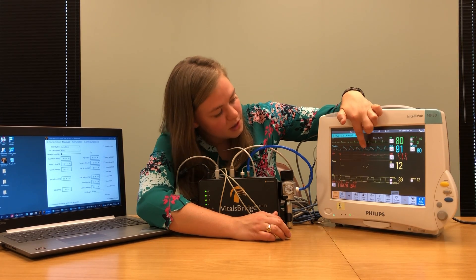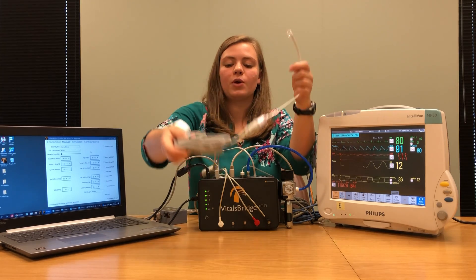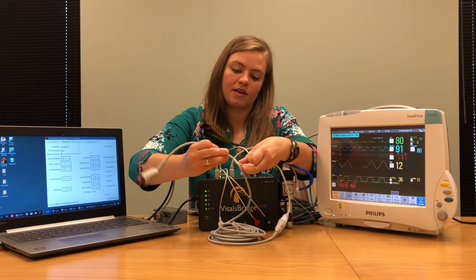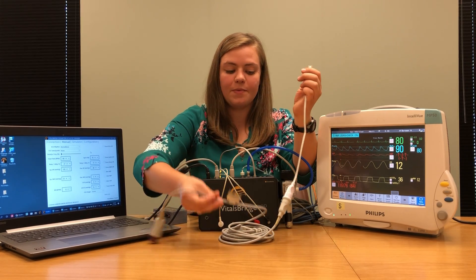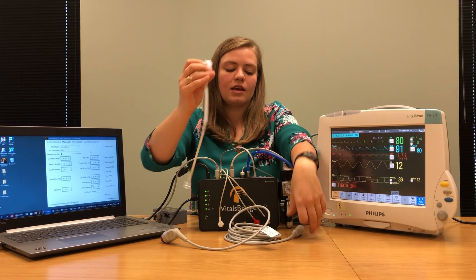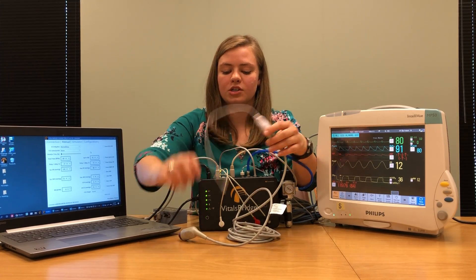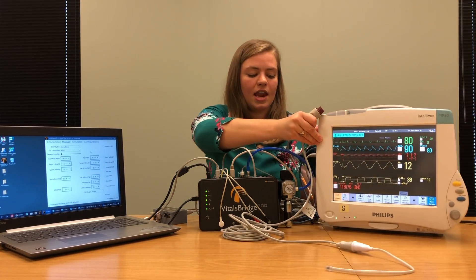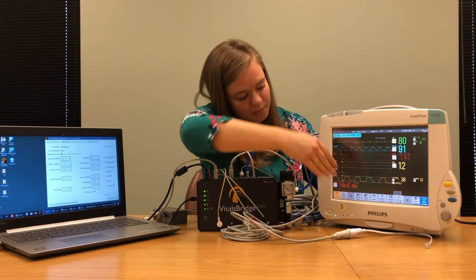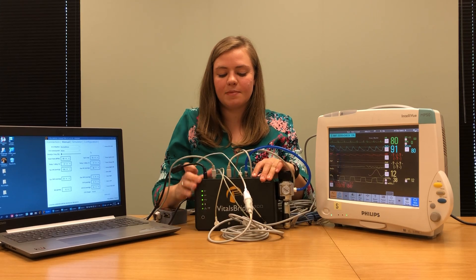Once that's plugged in, you should begin to see an ABP waveform. I'm going to connect one more invasive blood pressure using a different cable — a BD cable — to show you what might happen with a different cable. An adapter included with the VitalsBridge connects to the cable you already have with your patient monitor. Connect it so the two ridges match up, then plug this end into the patient monitor in any of those spots that says PRESS. I'm going to plug it into the PAP slot, and you can see the monitor says PAP and is looking for a PAP signal. Then I'll plug it into the PAP section on my VitalsBridge.